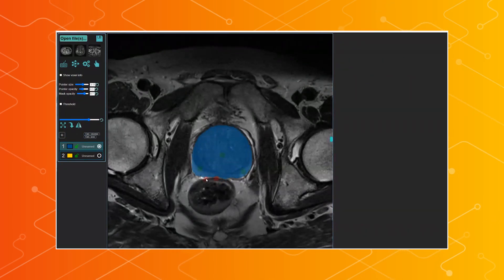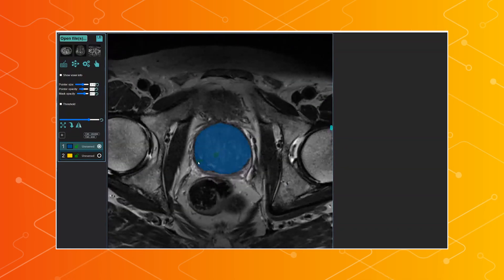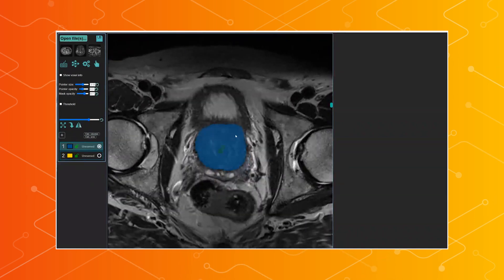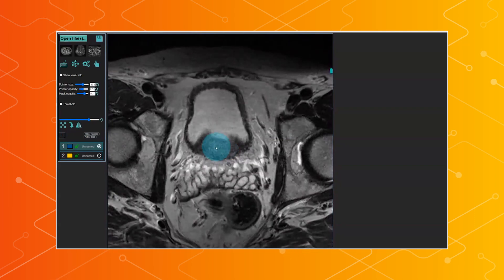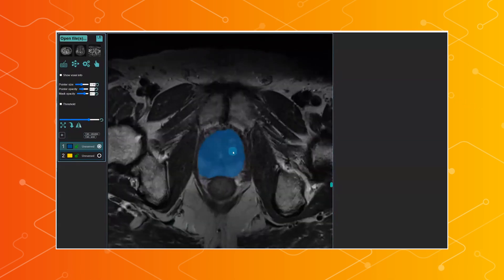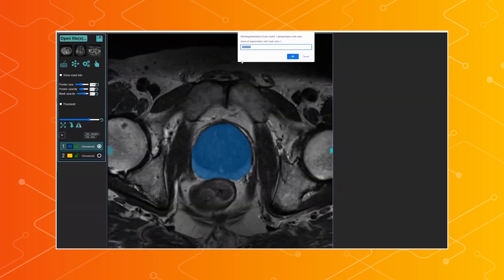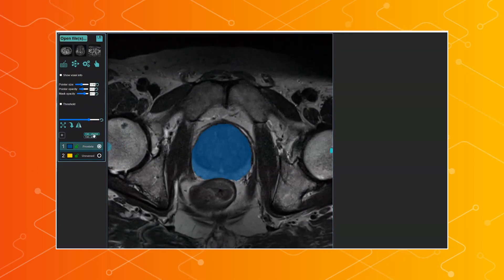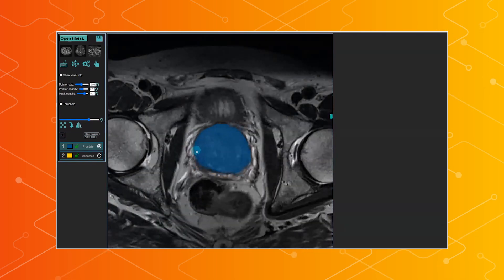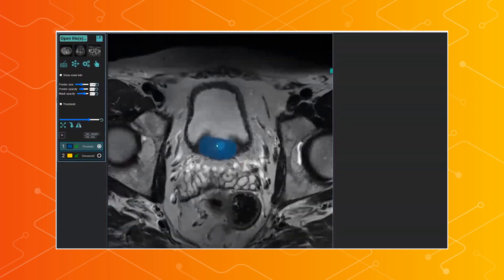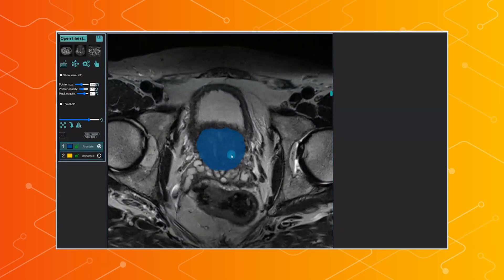This is a really nice thing with TensorFlow.js — you can interact with the AI models. It doesn't have to do fully automatic predictions, but you can actually guide the models to get the result that you want. Or you can still use manual segmentation, which would take too much time on many slices. We can just rename this to 'Prostate' for clarity and look at the volumes. I have segmented the prostate volume, which is 65 milliliters in this case — a fairly big prostate, but not pathologically big. This can be done for any structures in the human body that have CT or MRI scans.